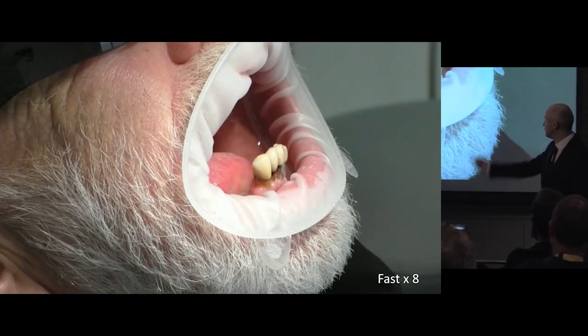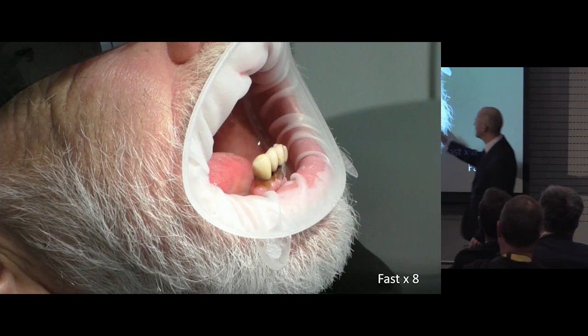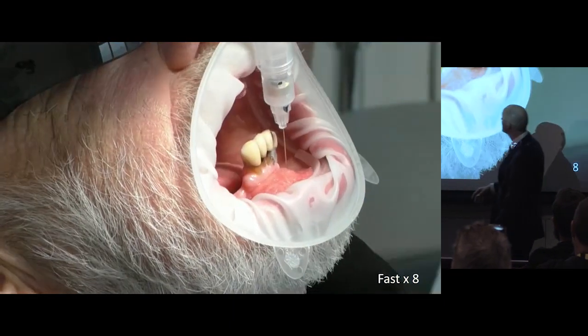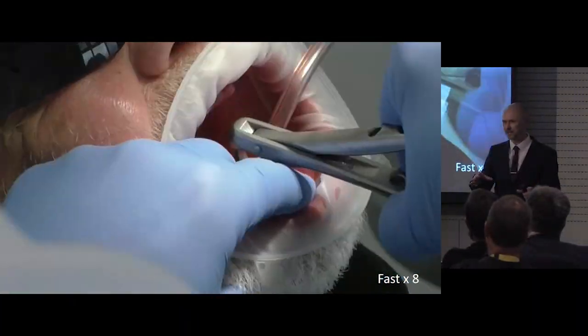So here we've got Bert. He's got caries, he's got periodontal disease. I'm going to take these teeth out, I'm going to extract them. And I'm going to fit a full upper denture and an immediate full lower denture for him.